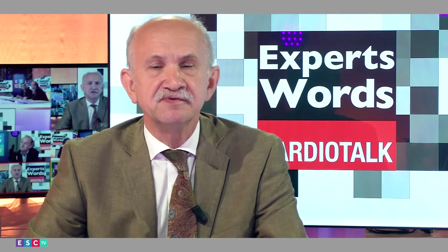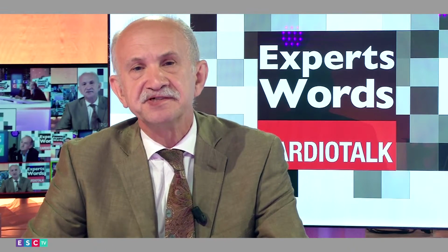Okay, let me summarize that. So we've been discussing discrepancies which are most important in low flow aortic stenosis and in multivalve disease. And the most important thing is to use echocardiography to its utmost, to use all modalities within echocardiography, interpreted clinically. And then if doubt still remains, we have the option of CT and CMR looking at calcium, looking at evidence of LV fibrosis, and these will become increasingly important as we gain data in the future. Thank you. Thank you to you, Guy. Thank you to you, Philippe Pibarot. Thank you.